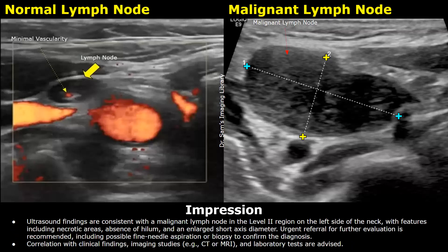The impression: ultrasound findings are consistent with a malignant lymph node in the level 2 region on the left side of the neck, with features including necrotic areas, absence of hilum, and an enlarged short axis diameter. Urgent referral for further evaluation is recommended, including possible fine needle aspiration or biopsy to confirm the diagnosis. Correlation with clinical findings, imaging studies such as CT or MRI, and laboratory tests are advised.